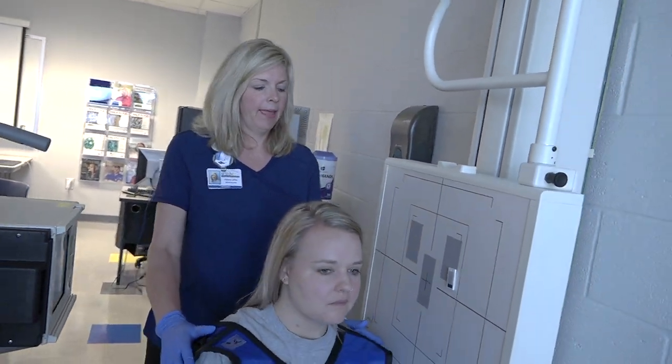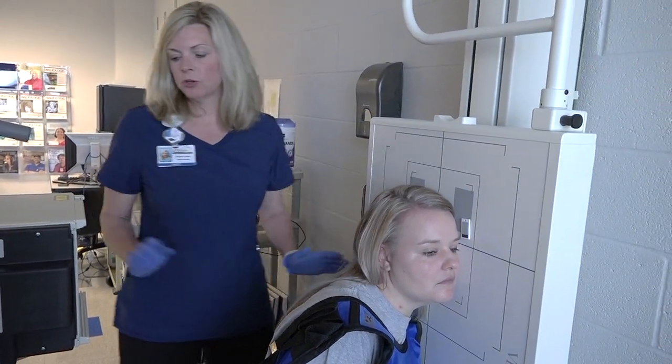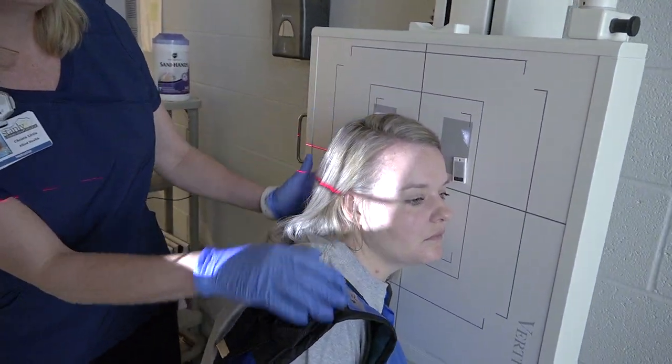We'll start out with the lateral, then we'll go to the Waters, and the PA, and then end with the SMV. So we'll have our patient turn, and we'll put the left side of the skull on the board here. Make sure there's no rotation or tilt.